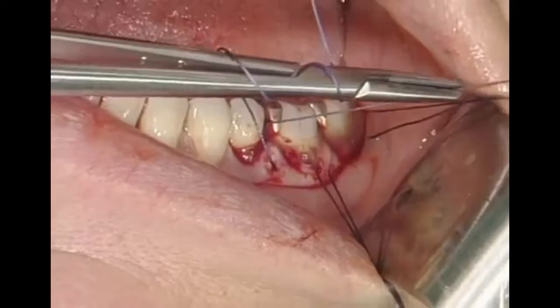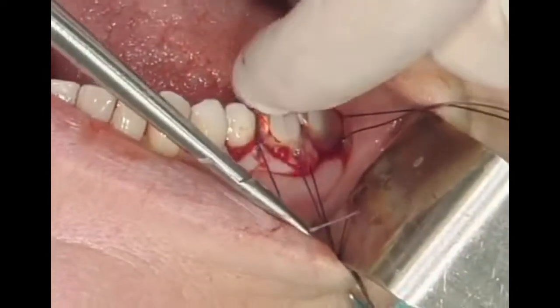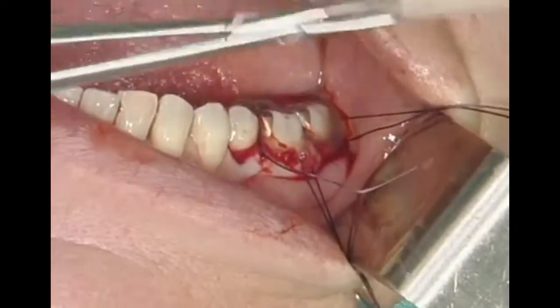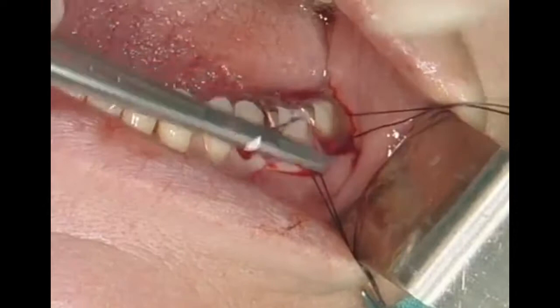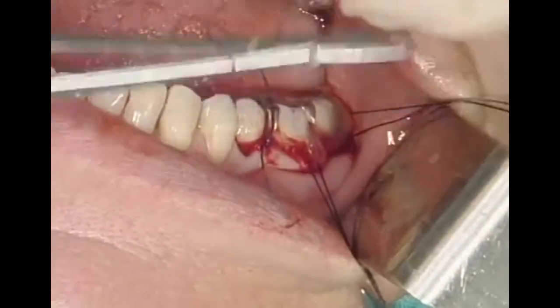The flap is finally closed using a tension-free technique. Here, the optimal adaptation of the soft tissue is essential. At this stage of the surgery, the assistance of a well-trained nurse is very helpful.